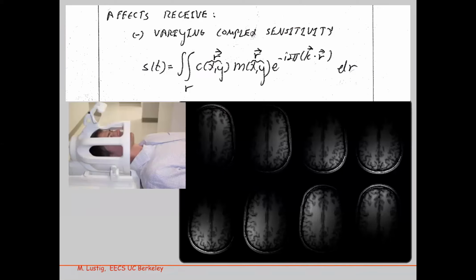So here's Phil Beatty. I don't know if you know Phil Beatty. Phil Beatty is a former lab mate of mine. Did our PhD together. And Phil worked in the area of parallel imaging, so imaging with multiple coils. And now this is a picture of a head coil, and pretty much this is one element of a head coil, and this is another element, and there's another element.